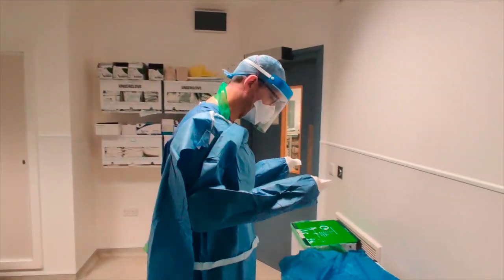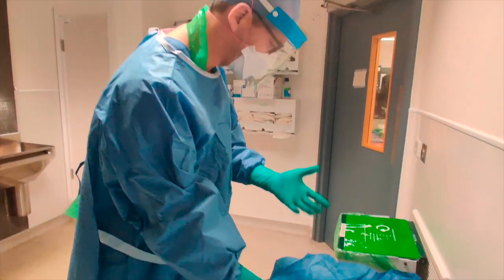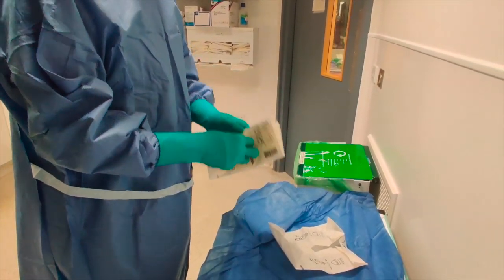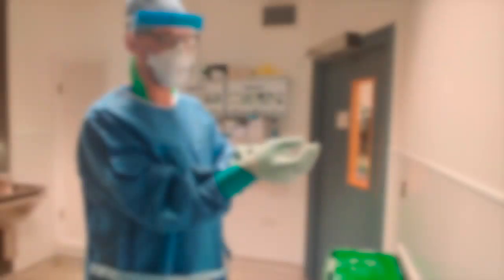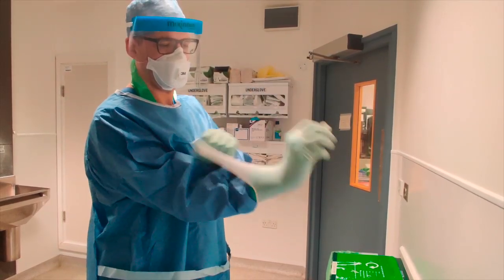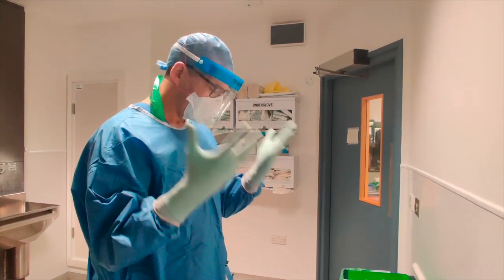We are going to double glove. I'm happy that I've got good coverage, then I will put in my second pair of gloves, making sure they come well above my second pair.